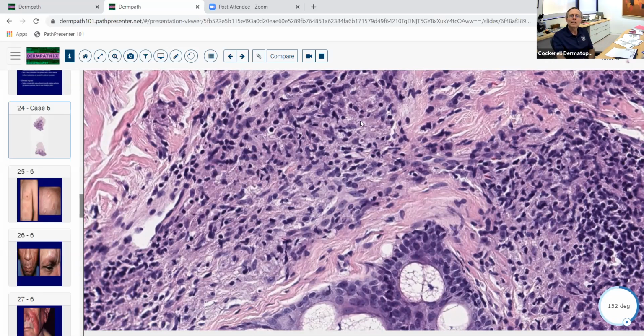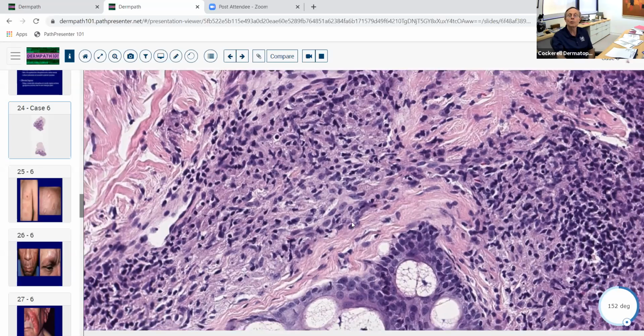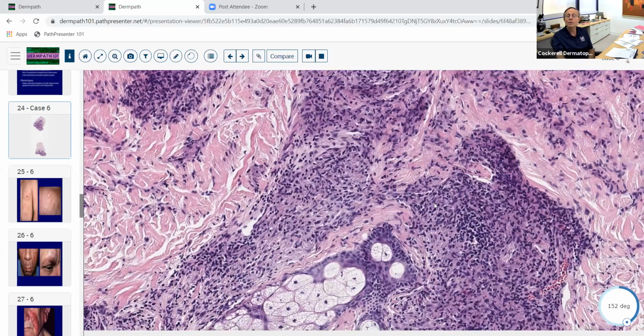These are maybe epithelioid granulomas. They are not as tightly packed as the epithelioid granulomas we see in classic sarcoidosis. This also has got a lot of lymphocytes in here as well. So we might think about something like syphilis in a case like this, if there are a lot of plasma cells, which there really are not. We might think about something like Hansen's disease. We might think about other kinds of infections. We might think about maybe an individual with HIV infection that's possibly got some kind of weird infection going on here too. So you always want to ask yourself all these questions here.